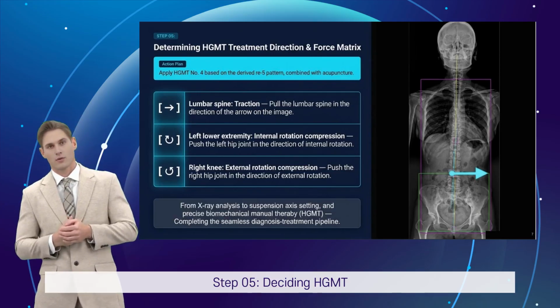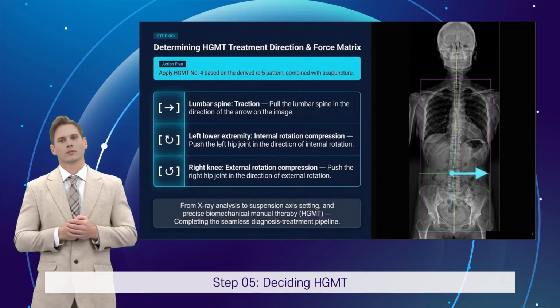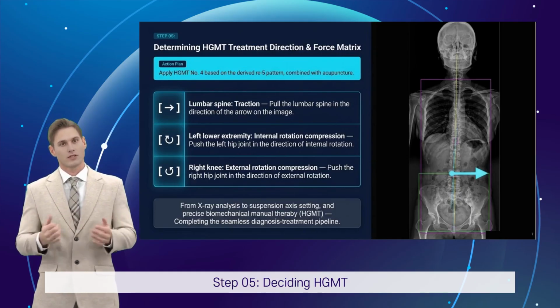And that completes the full protocol, from X-ray reading, to establishing the Hyun-Ga axis, to a precise, biomechanically grounded manual therapy, a seamless diagnosis to treatment pathway.